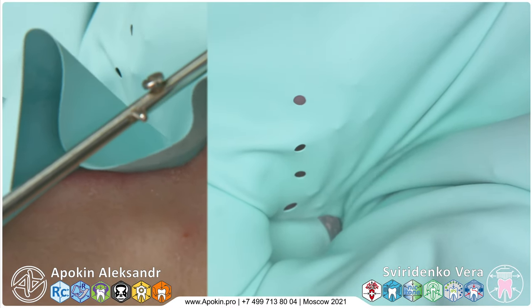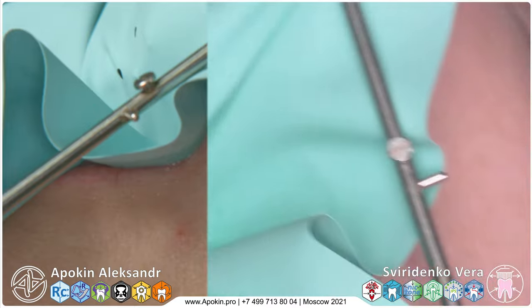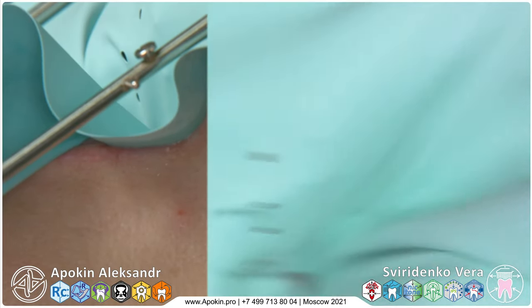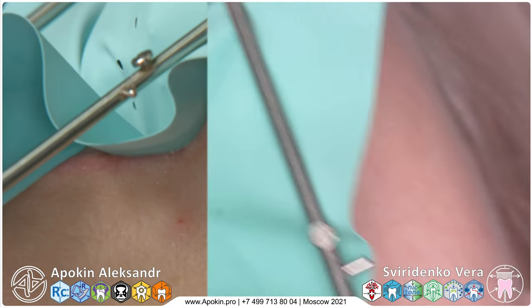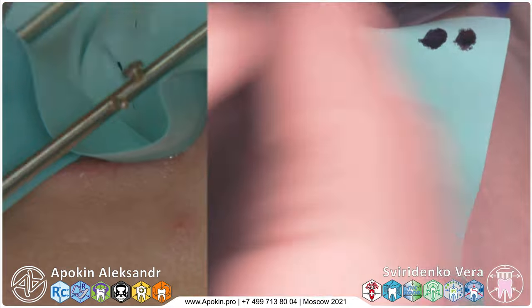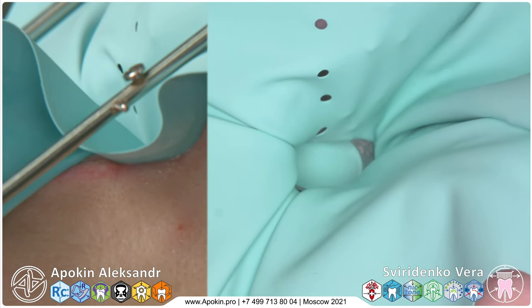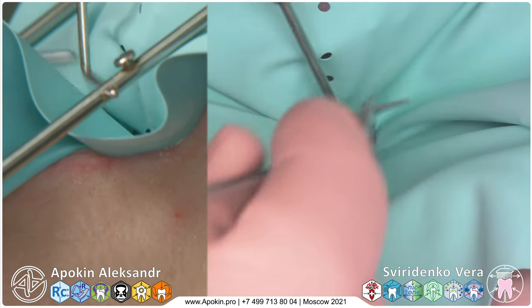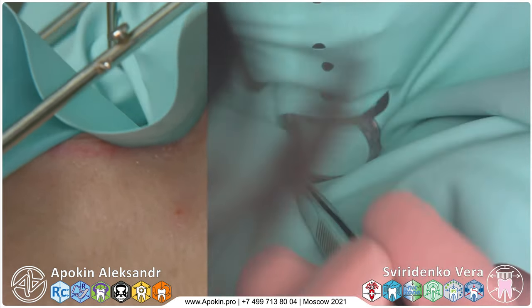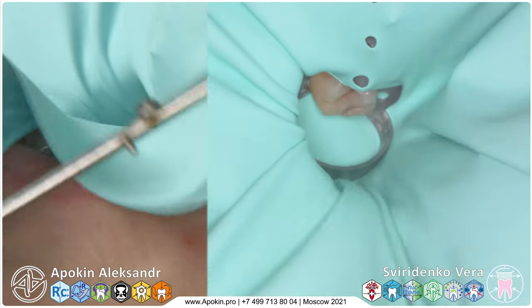If you have some problems during these operations, you or your assistant can make a very easy trick. Mark the angles of the rubber dam with different markers. Maybe it's very useful to make perforations with your puncture, or make marks. Then usually I make this part with the probe, because this is easier for me in distal areas to fix the rubber dam on the tooth.